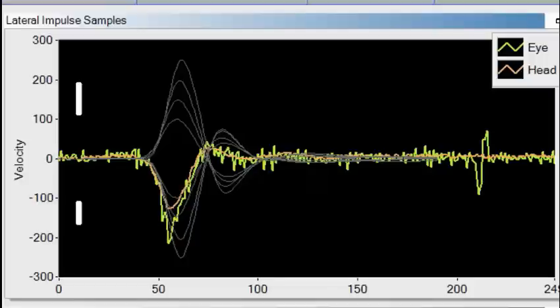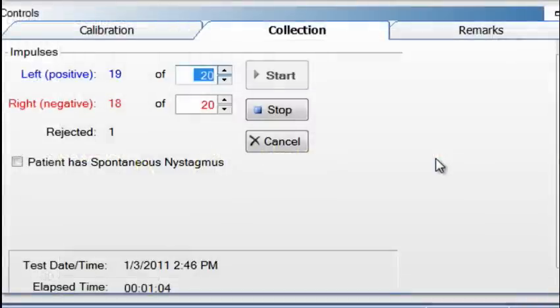The system automatically stops when the minimum numbers for left and right impulses have been reached. To manually stop the test, click stop. Data collection will be saved. Or cancel. Data collection will not be saved.